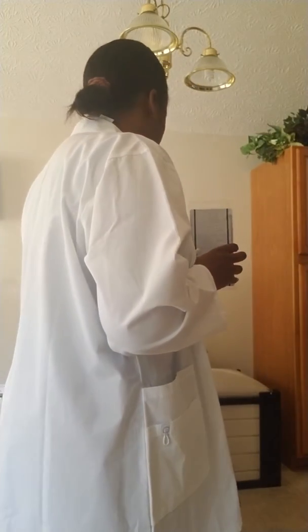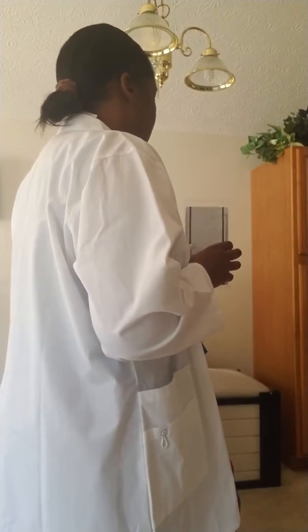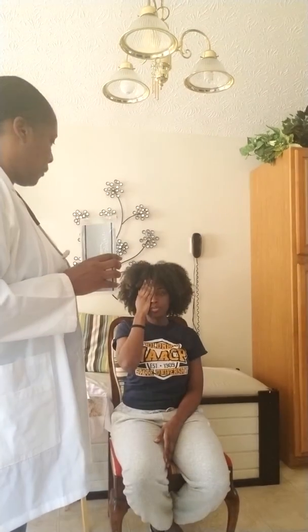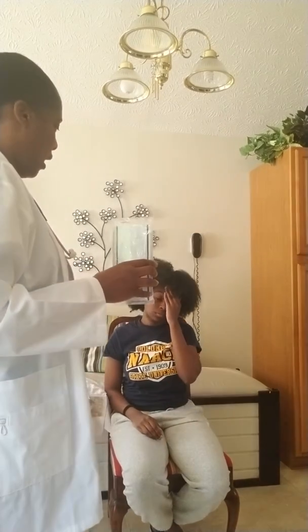Tell me the smallest line that you can read. LTFPH. I'm doing it with both of her eyes open at first, and now I'm going to have her close one of her eyes. I'm going to move to the left so we can see a little bit. LTFPH.